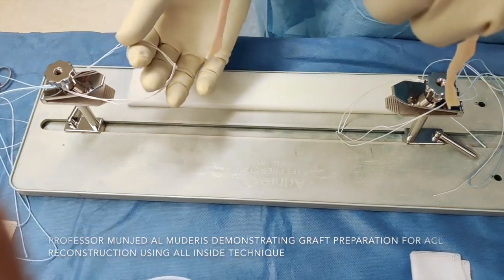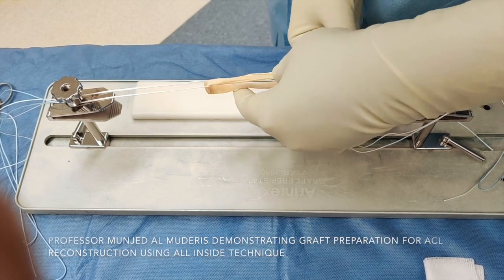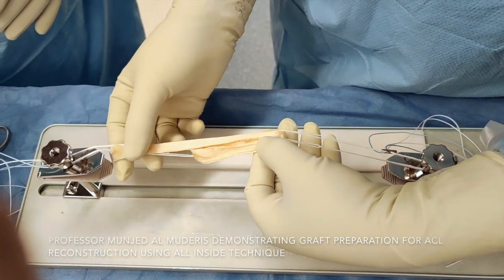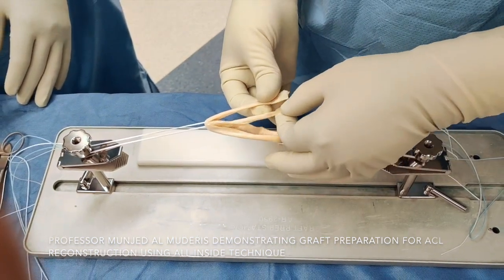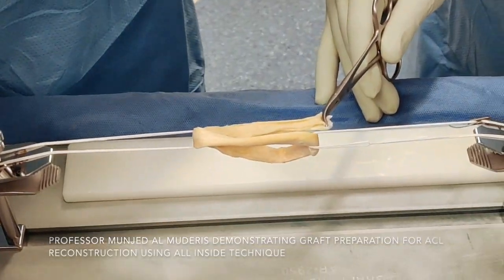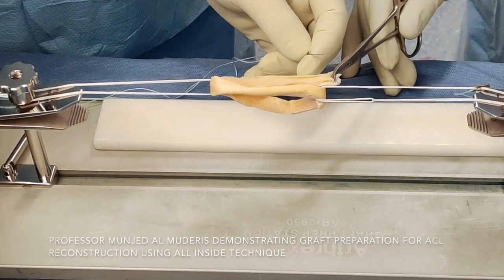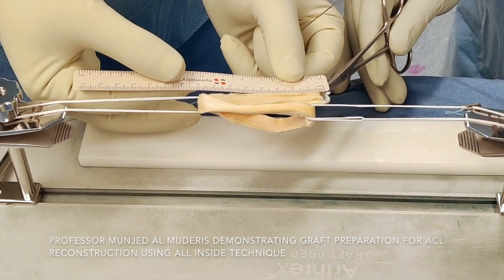The allograft tendon is passed from top to bottom. On average, I leave 6.5-7 cm of length. I fold it from the bottom upward and then from the top downward again. The two internal parts meet each other in the middle; I use an artery clamp to hold it together. I utilize a barbed suture to suture it together, measuring a distance of around 2.5 cm from the tip where I insert the barbed suture.